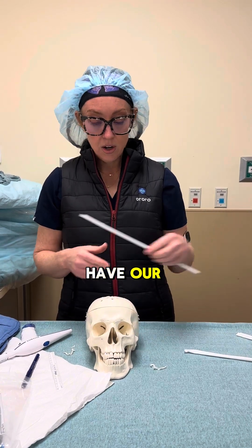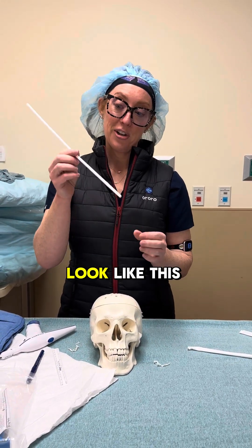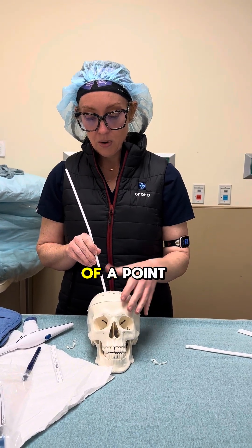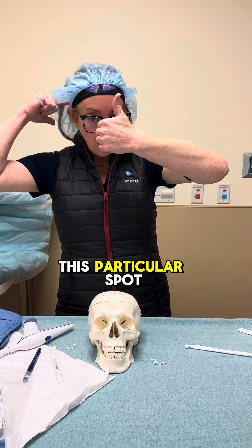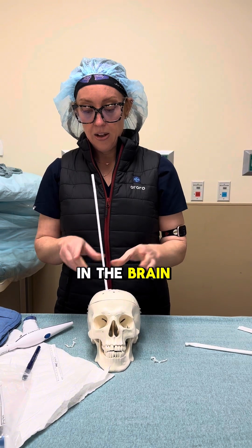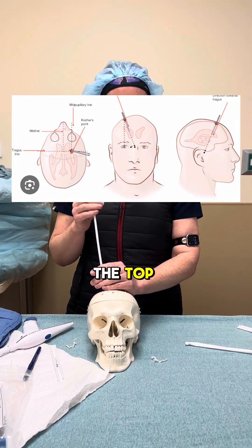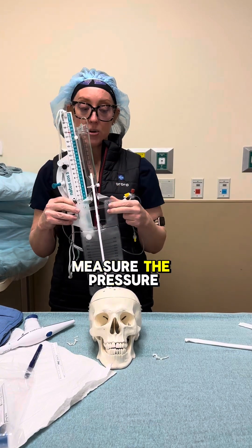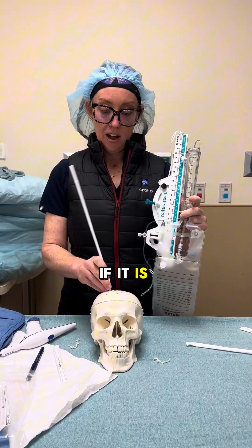Once we have our hole in the skull, I'm using drinking straws here, but our external drain catheter is similar — more flexible and bendable. We aim for the intersection of a line from the ear and the center point, and pass the catheter down into the brain to a safe depth. CSF, or spinal fluid, will come out the top. We connect this to a drain measuring device that allows us to drain spinal fluid, measure the pressure, and treat elevated intracranial pressure.